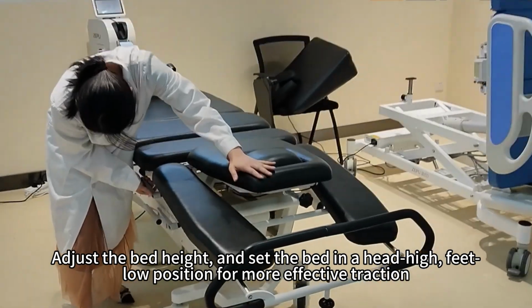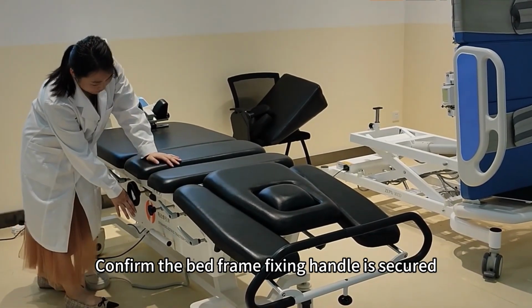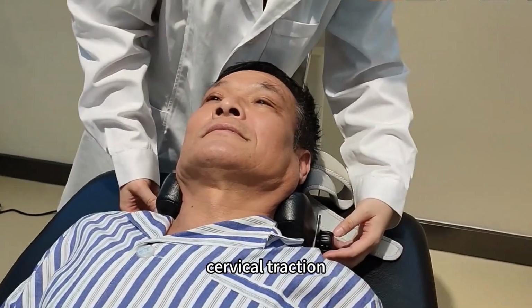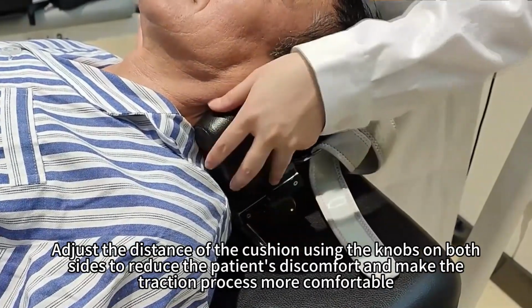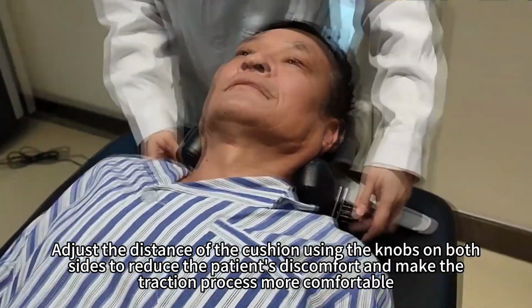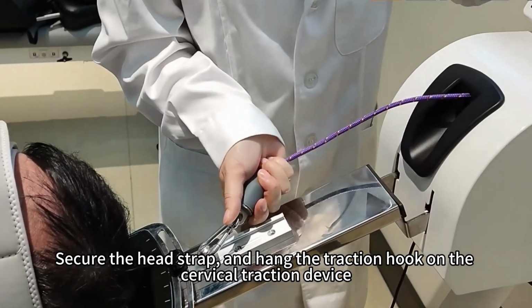Adjust the bed height and set the bed in a head high, feet low position for more effective traction. Confirm the bed frame fixing handle is secured. Cervical traction. Place the patient's head in the cervical traction cushion. Adjust the distance of the cushion using the knobs on both sides to reduce the patient's discomfort and make the traction process more comfortable. Secure the head strap and hang the traction hook on the cervical traction device.